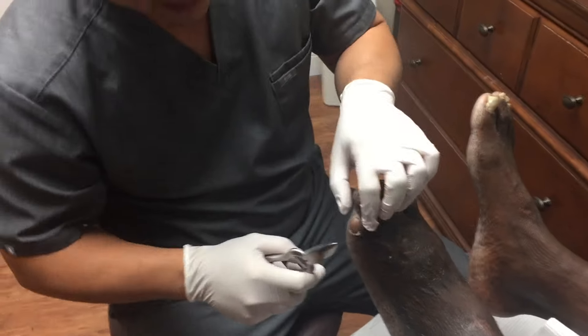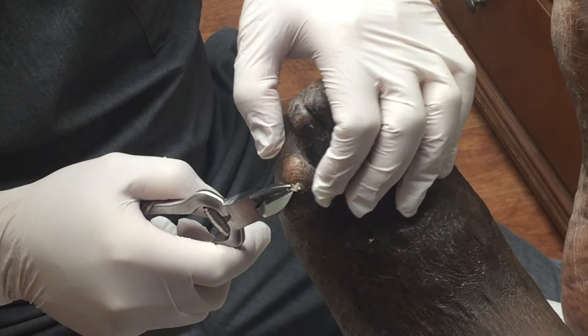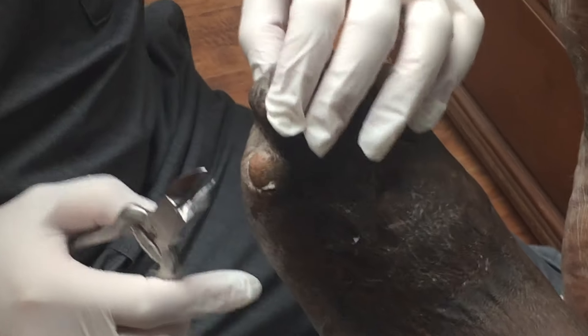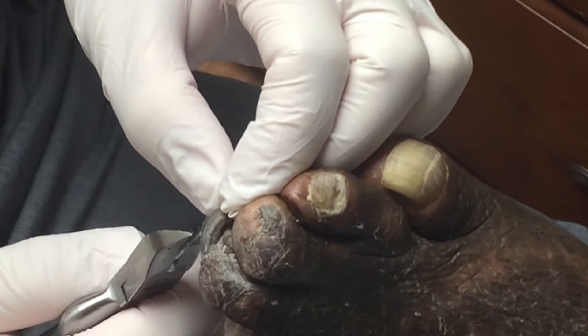So as the story goes, he's giving me a brief history of his foot. He had an accident when he was a little bit younger, hence the slight foot deformity. So we're gonna work on getting him as comfortable as possible.